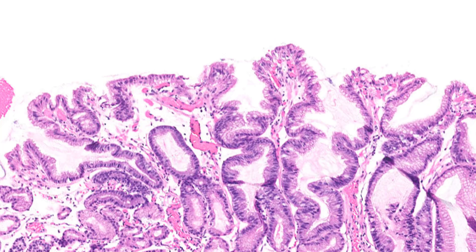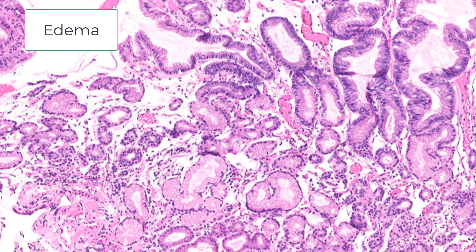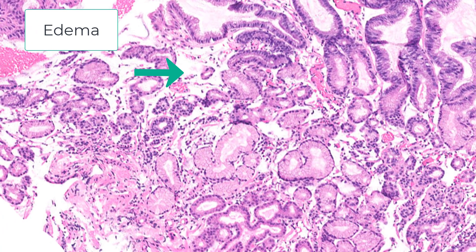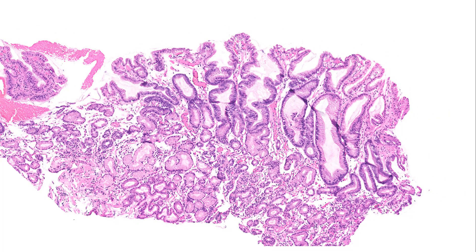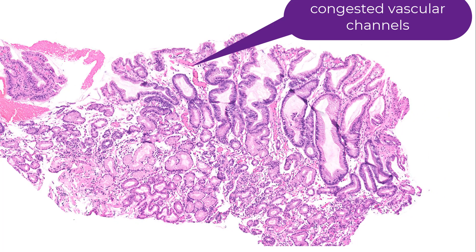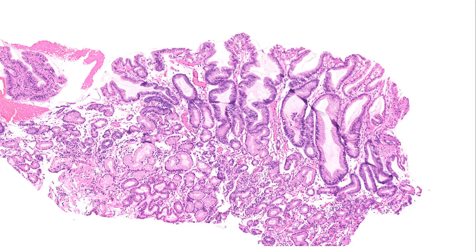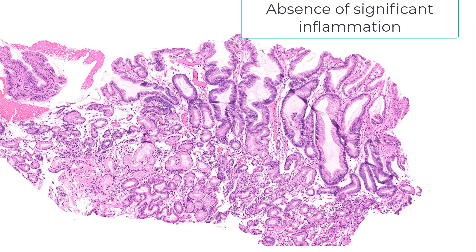Feature number three is edema. Feature number four is smooth muscle proliferation — I don't really see it here, but that's okay. Feature number five is those congested, dilated vascular channels, which are not too obvious. Feature number six is the absence of significant inflammation.